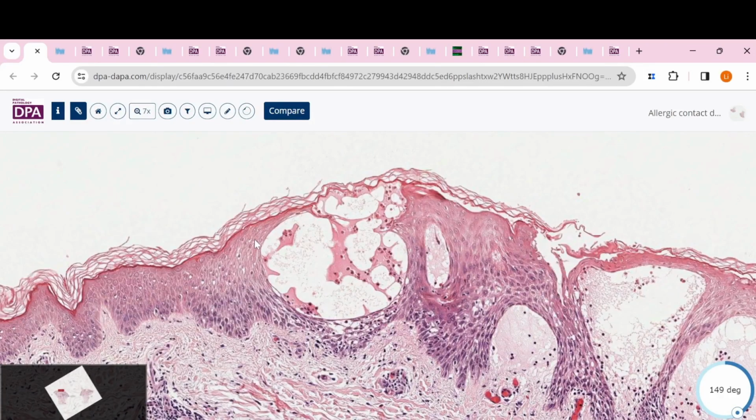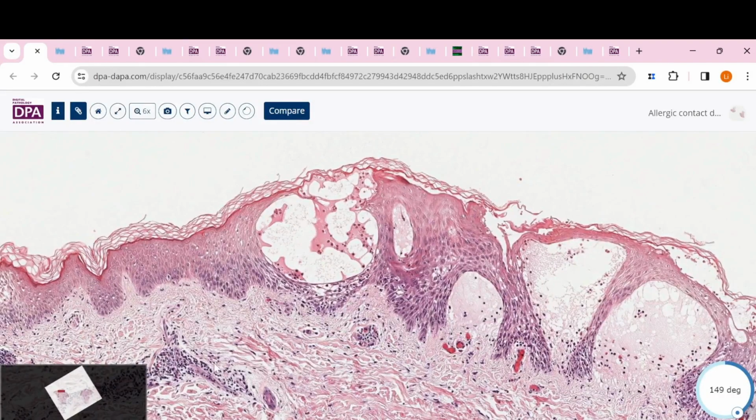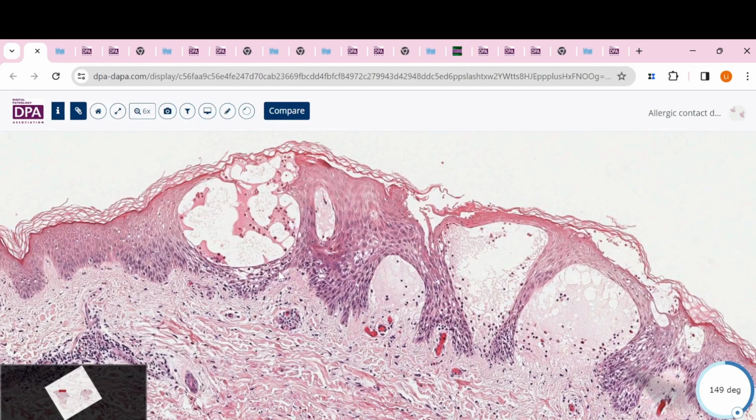And then we can see really dramatic spongiotic dermatitis. We can also see this basket-weave stratum corneum. That means this whole process happened really fast, so the basal cell layer cells do not have enough time to proliferate too fast and maintain their nucleus in the stratum corneum here. And then in the epidermis, you can also see some eosinophils and perivascular lymphocytic infiltrate. So if you see this picture and the first clinical picture, you can make the diagnosis of allergic contact dermatitis. But you just could not rule out irritant contact dermatitis at the time of the spongiotic dermatitis. You just favor this one.